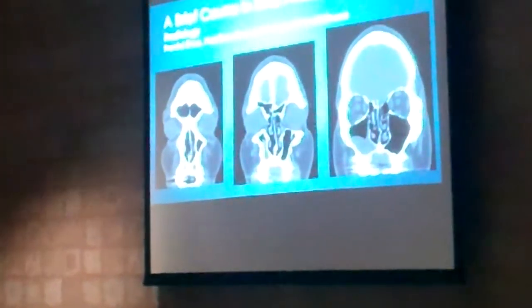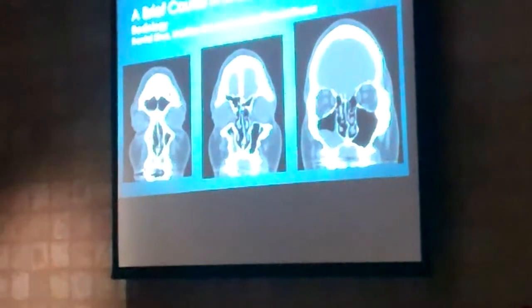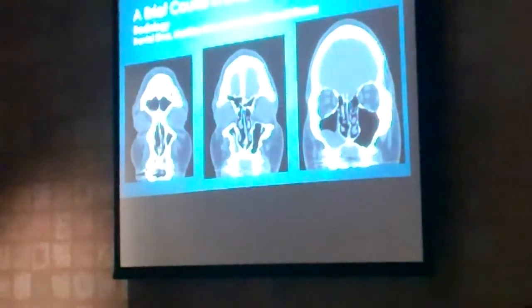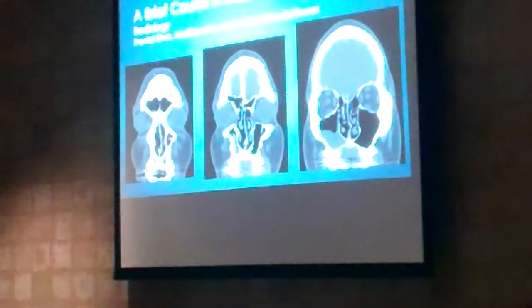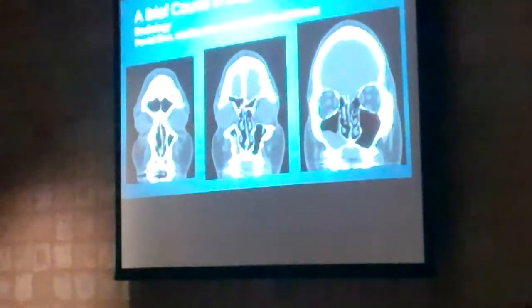This is the frontal bone. This is the right eye, that's the left eye. This is the septum. It divides the nose into a right and left half. You can see just the beginning of the maxillary sinus, the sinus under the eye. And then here's good images of the teeth. If we go back a little bit further, we can see that the frontal sinus is now getting smaller because we're getting to the back end of it. You can see a little bit more of the maxillary sinus, and then you start seeing there's some important structures that I'll show you later on. I may quiz you on these, so pay attention.